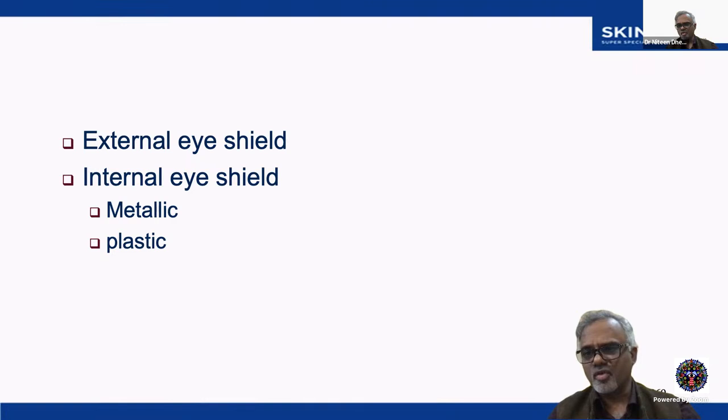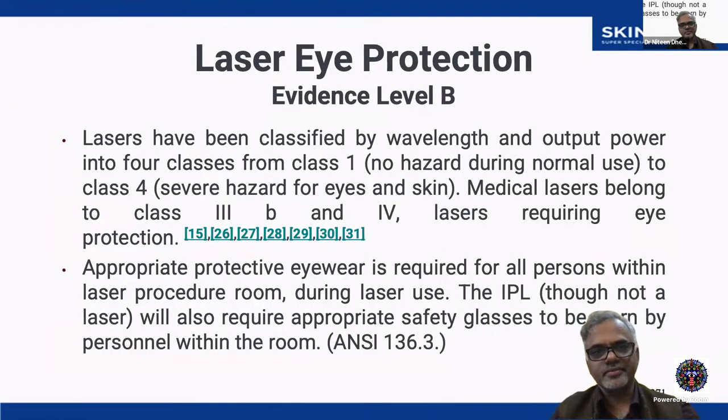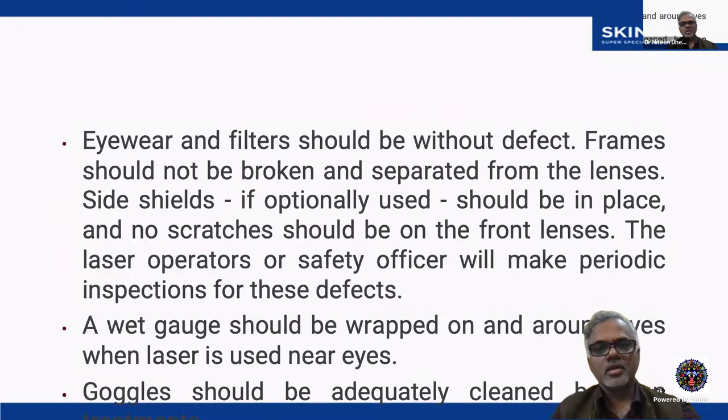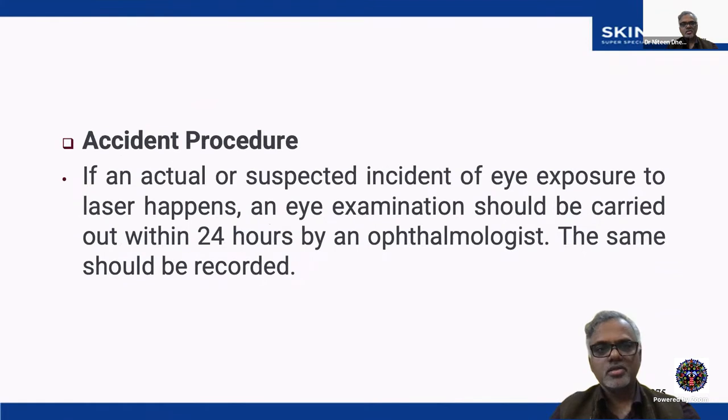So I will share my article. There are minimum standard guidelines of care for the requirements of setting up a laser room. So, how to set up a laser room. In that, lastly, I have mentioned laser eye protection and how to use the eye shield, what the power of that eye shield should be, how the goggles should be used, how the goggles should be maintained, and in case of an accident, what the SOP should be if you get accidental fire around the eyes or in the eyes.